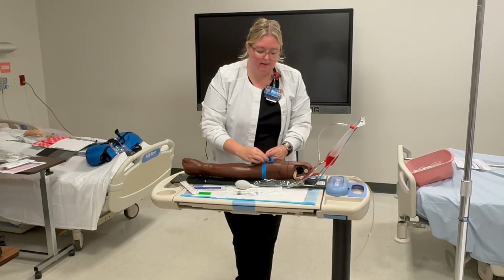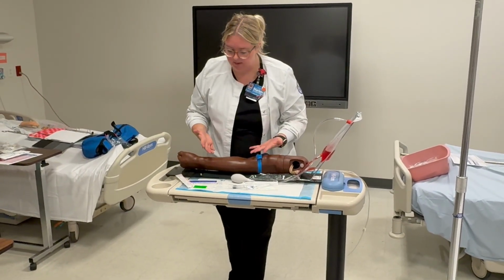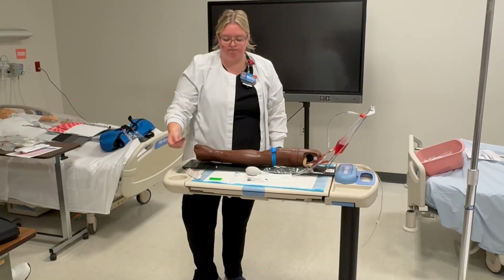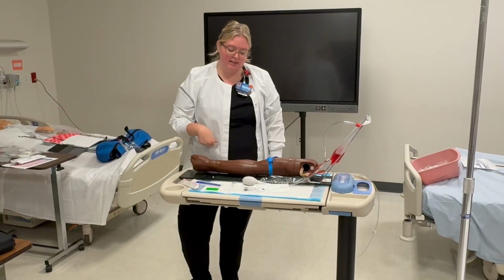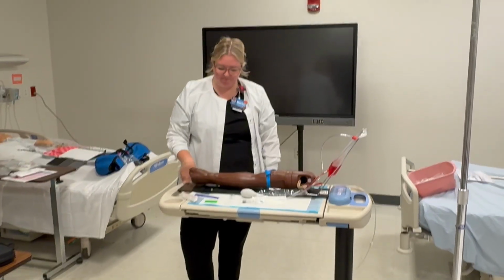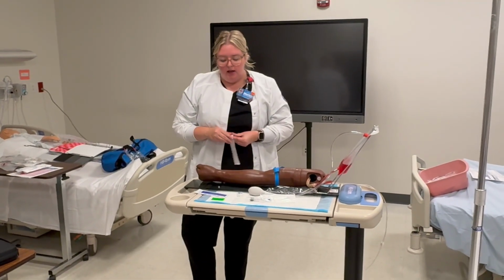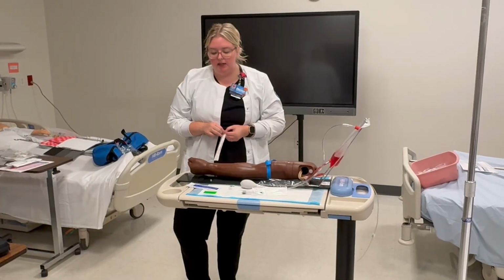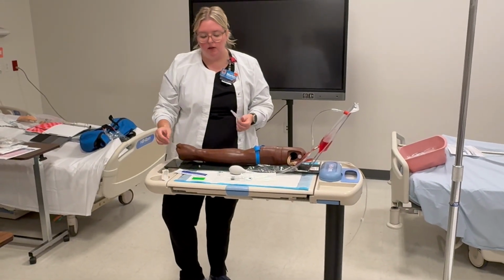tourniquet back on again. It doesn't matter how tight your tourniquet actually is because it doesn't change the veins or anything on the mannequin. We're gonna clean, clean, clean, clean, clean. I'm gonna fan it dry, right? No, that was a test. Okay. All right, we're gonna leave the tourniquet on now. I'm not going to repalpate the site. I already picked it. That's per best practice in real life.